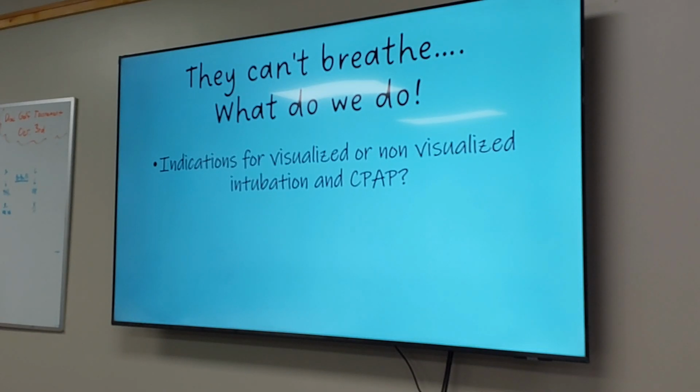What are your contraindications for CPAP? They can't maintain their own airway, they're not able to follow commands? Yes. Okay, I figured that's what that meant. What else? Facial trauma. What else? Are you going to put a CPAP on somebody with a pneumothorax? Sure, why not? Let's blow it out. Make it bigger, make it worse.